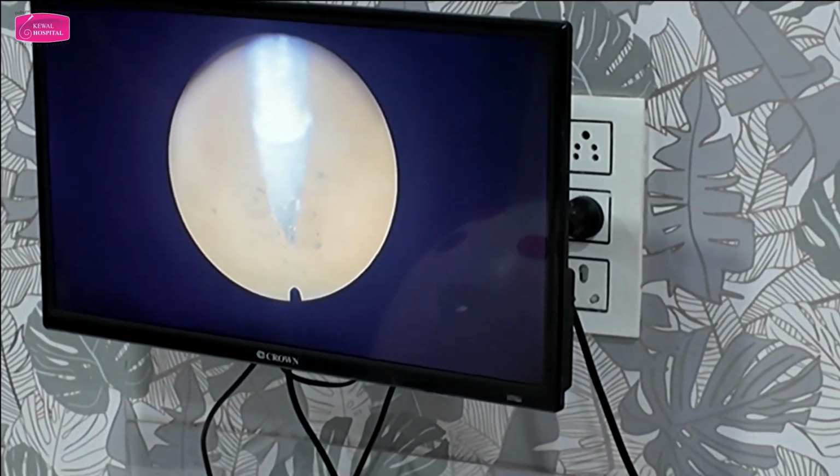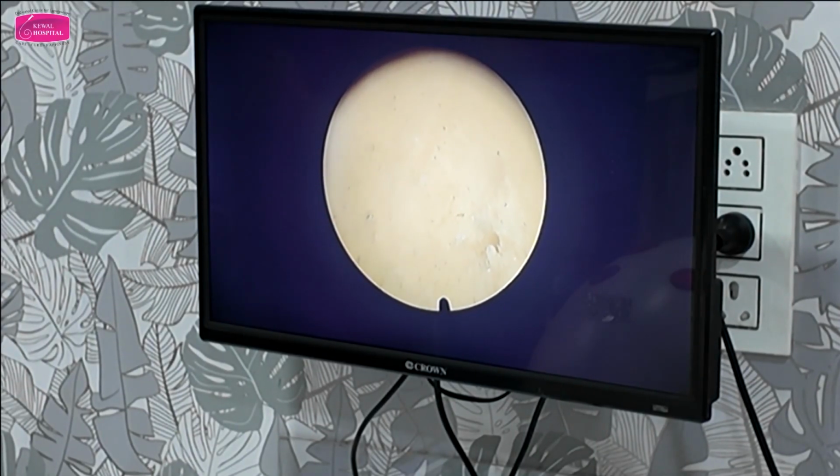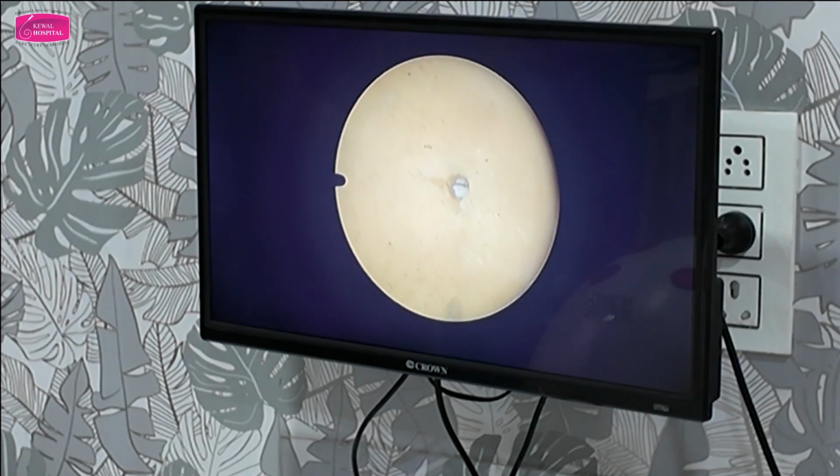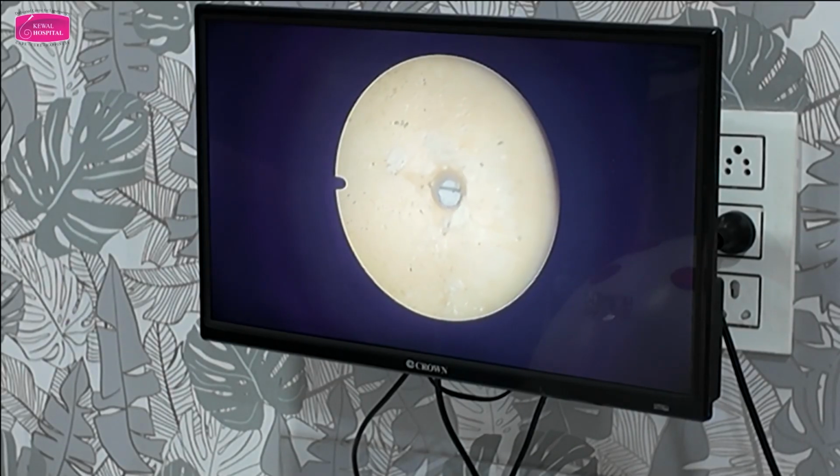You want to cut the septum. Clear? Suppose you want to do the cannulation on the left side. Okay? You have to go near the ostia and stay like this. And then introduce the cannulation wire through the operative channel.